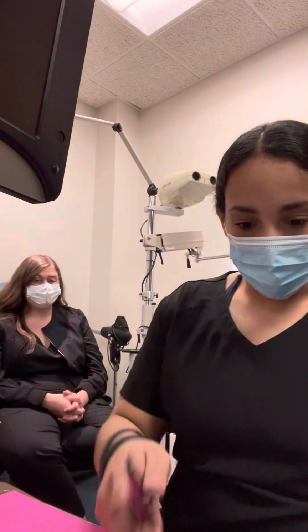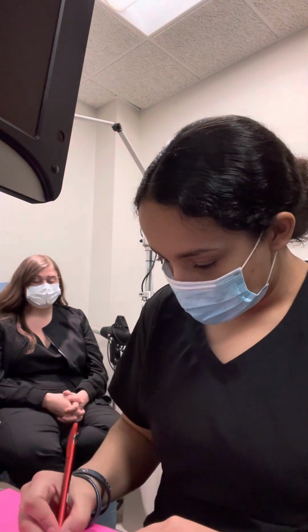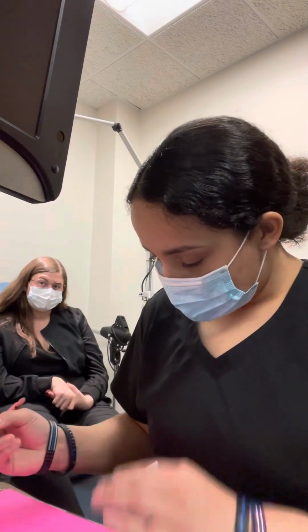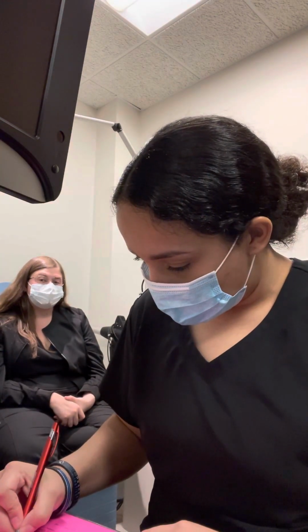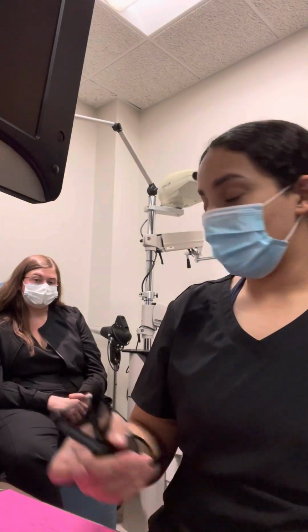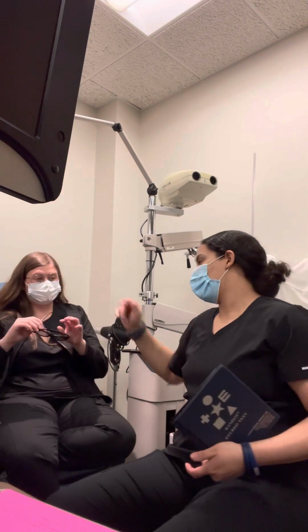All right. Okay, so for color vision, she is a 10 out of 10 in her right eye, a 10 out of 10 in her left eye, method HRR. Alrighty, Miss Barber, next we're going to be checking your depth perception. Okay, so what I'm going to have you do is put these over your regular corrections.